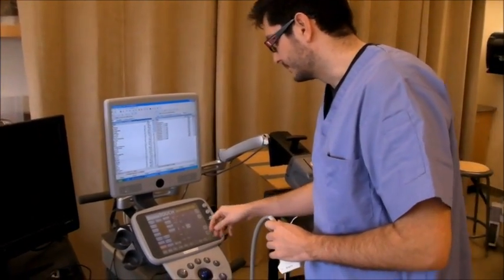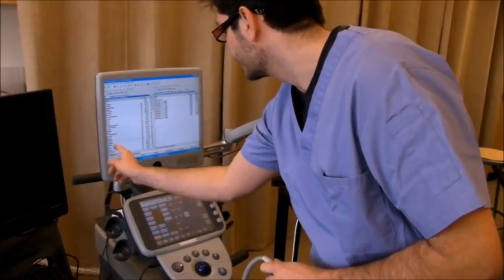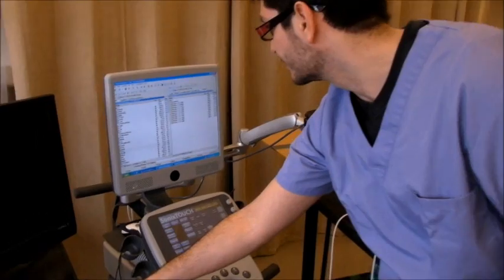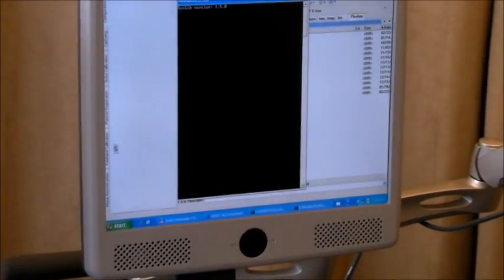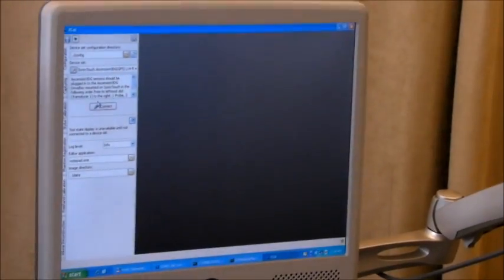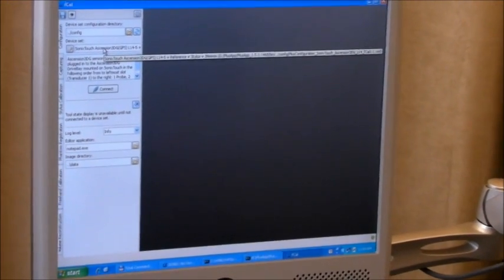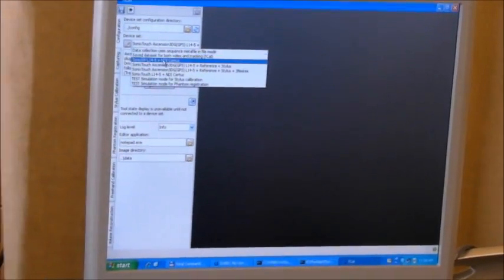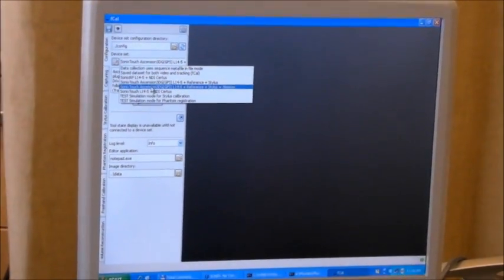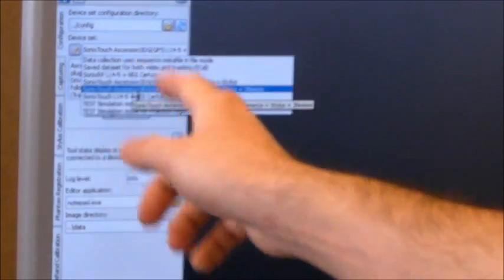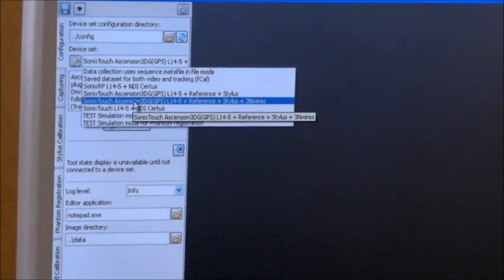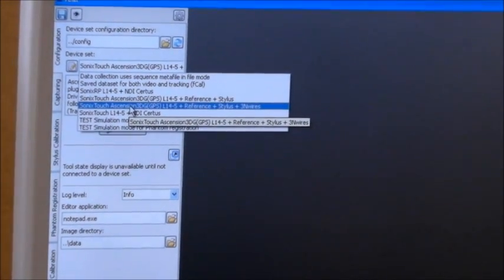I'm starting the fCal application from the PlusApp Binary Directory. I select the proper configuration file that you can find in the package.